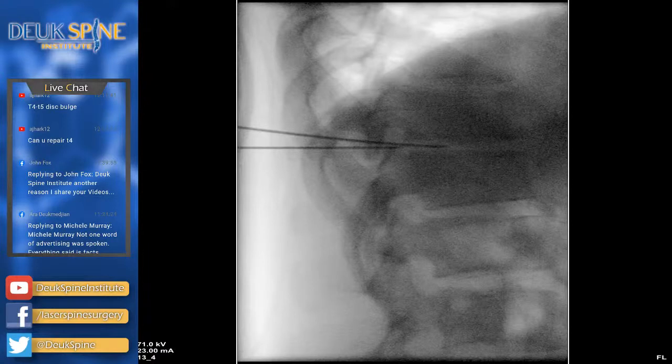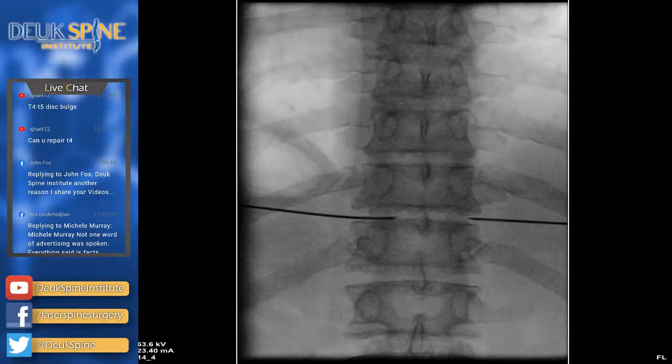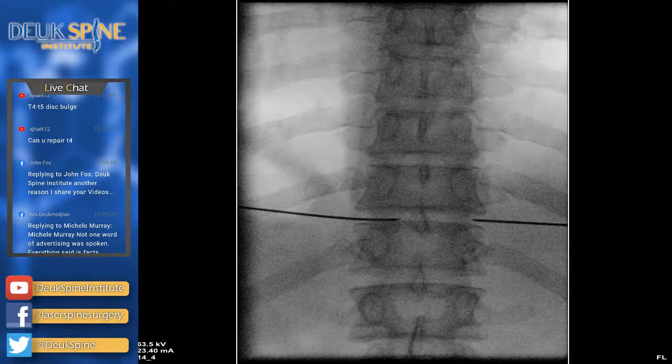So if you're sailing a boat out in the middle of the ocean, you use the stars for reference. Before there was global positioning satellites, you would use the stars, you would use land features, islands, basically fixed points to navigate so you don't destroy your ship and kill your crew and jeopardize your mission. We do the same thing here in spine surgery. We use fixed points to navigate. And those fixed points are the spine and the tissues around the spine, but mostly the spine, because that's what an x-ray machine will see. Go ahead and go lateral. That's perfect. So we're in absolutely perfect trajectory again.